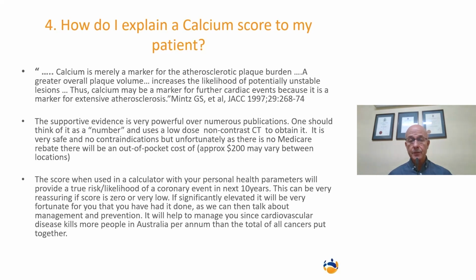However, a calcium score in an older patient is much more beneficial, and we'll get into that a little bit later. So all we can tell the patient is that in broad-based studies, a low calcium score is a good thing. In young patients, we don't have much evidence to suggest they don't have plaque. In over 70-year-old age group, if your calcium score is still 0, that is a very satisfying result and very reassuring.